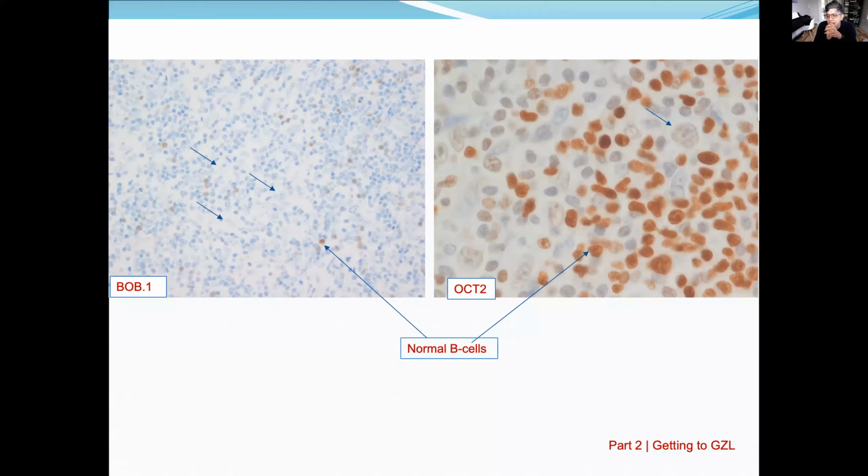It's a normal cell, I'll tell you that much. Yes, Dr. Jassim, or maybe Alanandal, you want to take? Perfect. Sarah has said that it's a dendritic cell. She's exactly right. This is a follicular dendritic cell, and that's how it looks. Two nuclei touching each other like that.